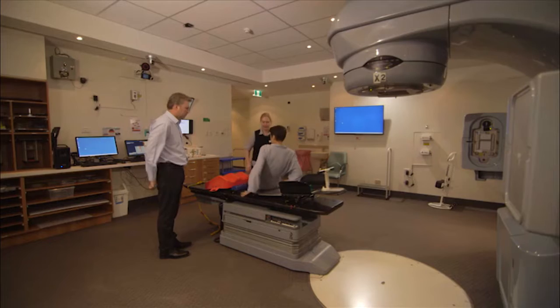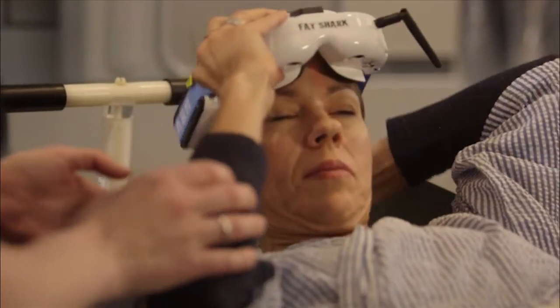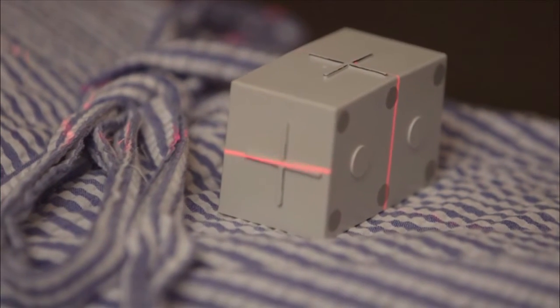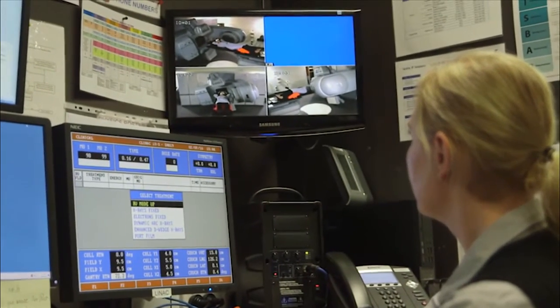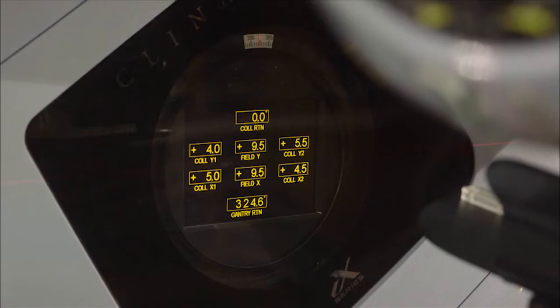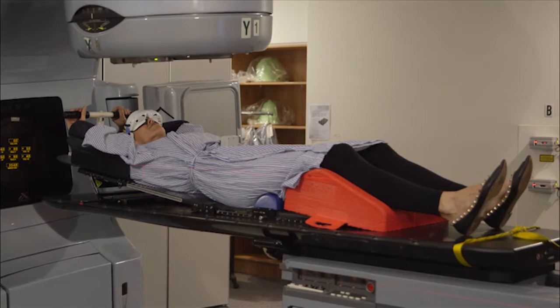During treatment, you'll lie down on the machine and get into the same position you were in when you had your CT scan. You'll hold your breath a few times using either the snorkel or goggles to complete the positioning image and treatment. Your radiation therapist will step outside briefly while the scans are being taken, and they'll monitor you from a nearby room. They'll guide you over the intercom as you breathe, using the breath hold technique. You're in complete control at all times and can stop treatment at any time.